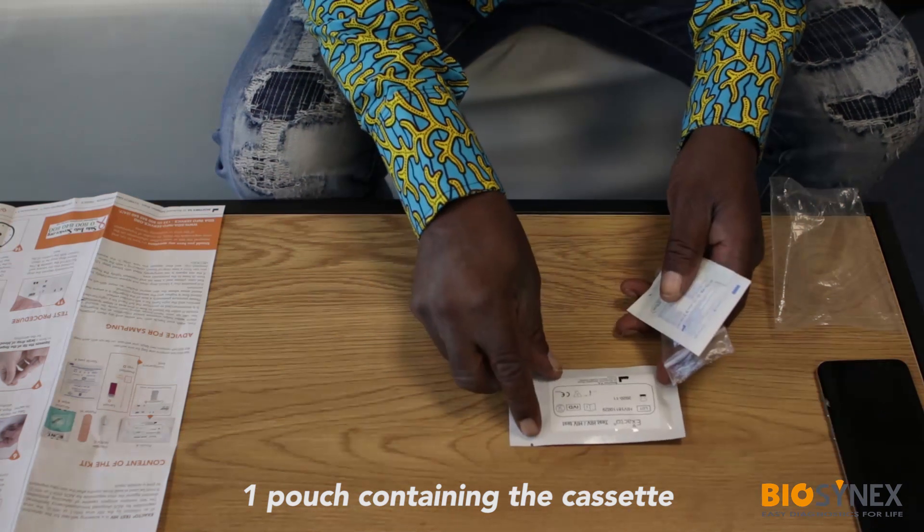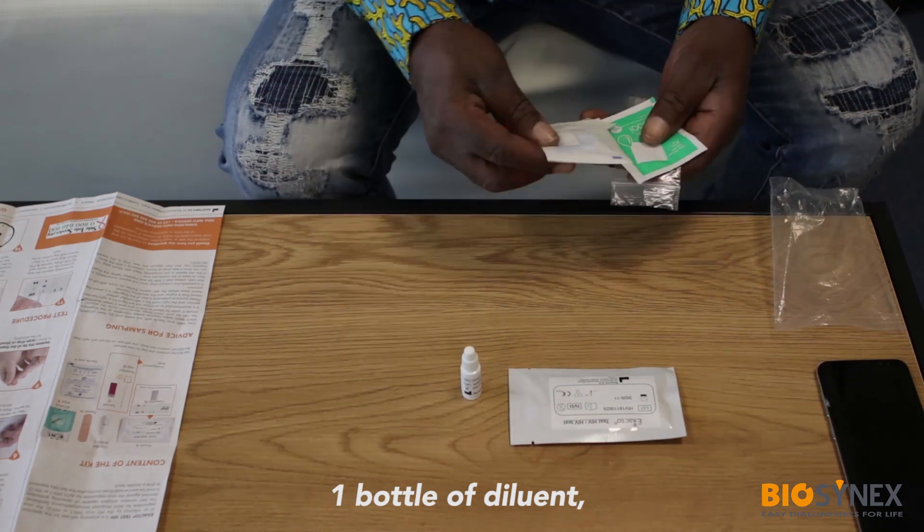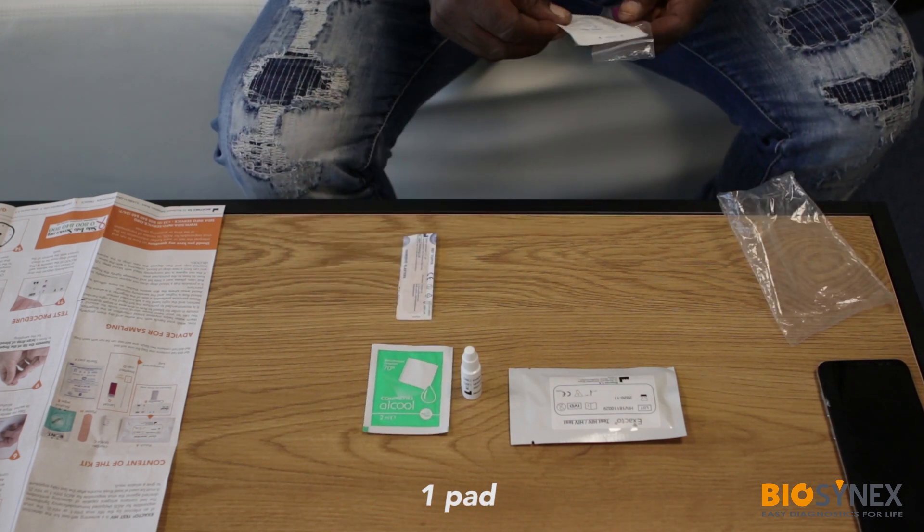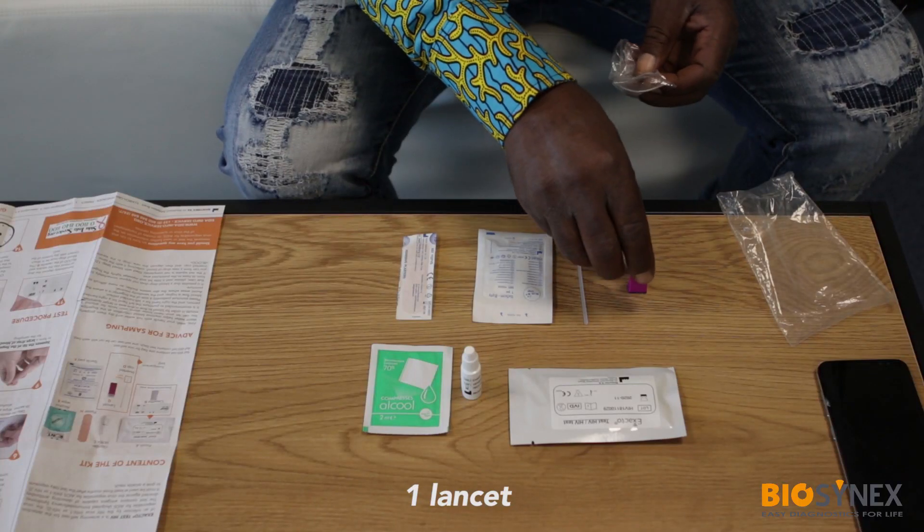You should have one pouch containing the cassette, one bottle of diluent, one alcohol wipe, one plaster, one pad, one blood drop collector, and one lancet.